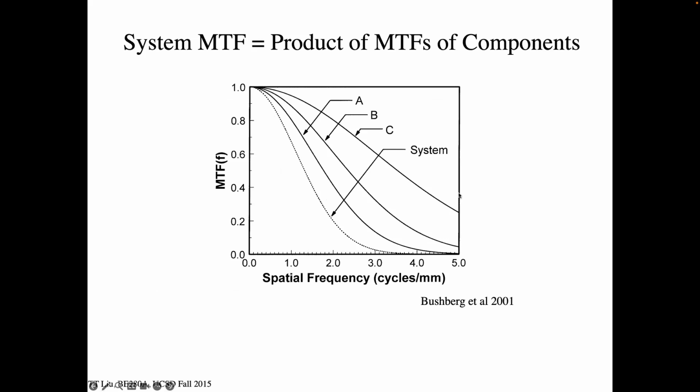And when we go all the way back now to the modulation transfer function, where we look at the ability of a system to transmit higher frequencies, the modulation transfer function drops as our spatial frequencies get higher. This means things that are at 1 cycle per millimeter are being transmitted through our system with higher amplitude than those signals that are at 2 cycles per millimeter. And this shows the continuous function.